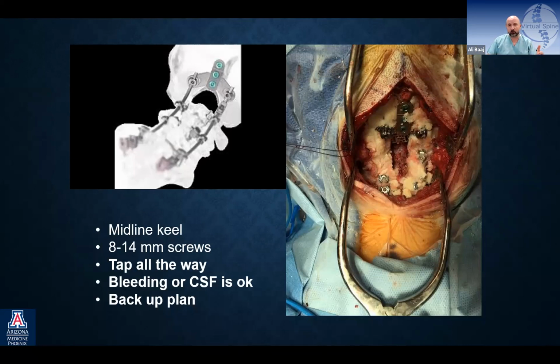You have to tap all the way. As we know, the occipital bone is very dense, it's highly cortical, and it's very important that you tap all the way.